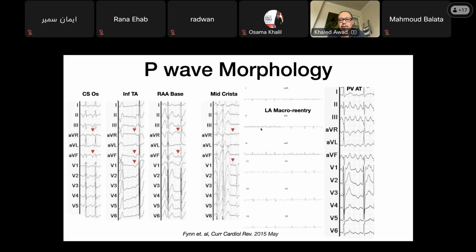Conventionally, you would call that atrial tachycardia, which then translates in our brains as focal. It's a focal rhythm. Okay? That's not always true. That's not correct. So I don't want to think about it that way. Now, if you were reading an EKG and that's all you had, I would call this an atrial tachycardia. If I was reading that EKG on the right, I would call that an atrial flutter. Why? There's not an isoelectric segment.